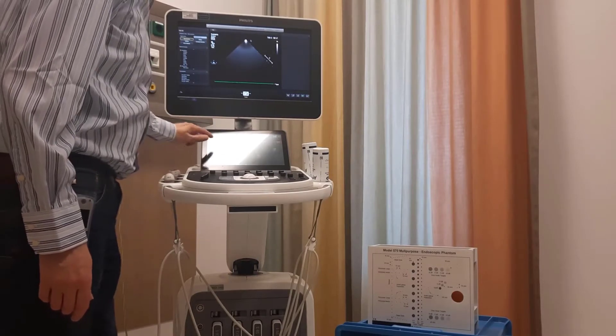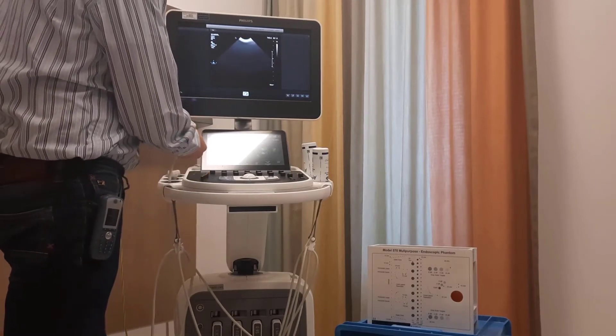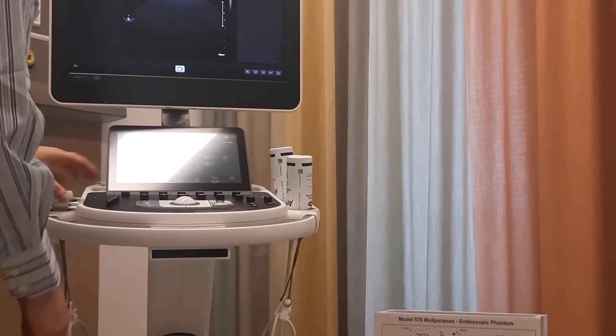This is the convex transducer. You can see that when I touch the face, you can see an ultrasound image.